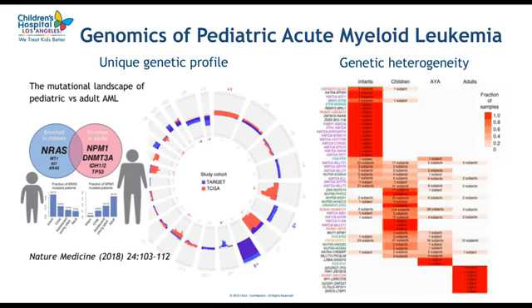In addition, in pediatric cases, you have very high heterogeneity of genetic drivers, and they tend to be fusions that are individually very rare, but collectively fusions are the key drivers in pediatric AML. And they arise from structural rearrangements, which are challenging to detect by existing methodologies with high resolution. And also, because of high heterogeneity, targeted assays are not working very well. So you need methodologies that will allow for efficient genome-wide detection of structural changes.